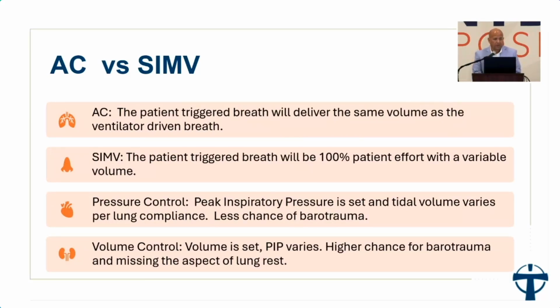And I think nowadays everyone's going to pressure control for their patients on ECMO. But I remember early in my days, I had hair back then, we did volume in some patients, and we realized, whoa, these pressures are crazy. What are we doing? So we learn as we go. But most people do pressure nowadays, and it's just easier.